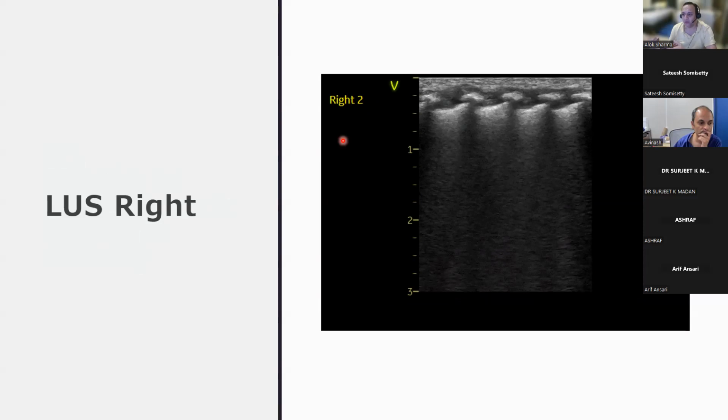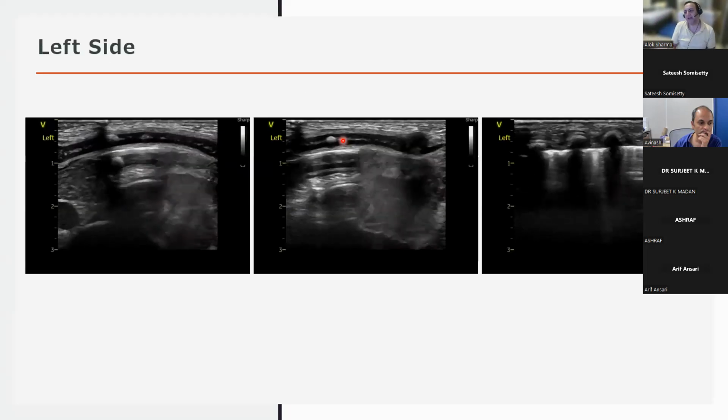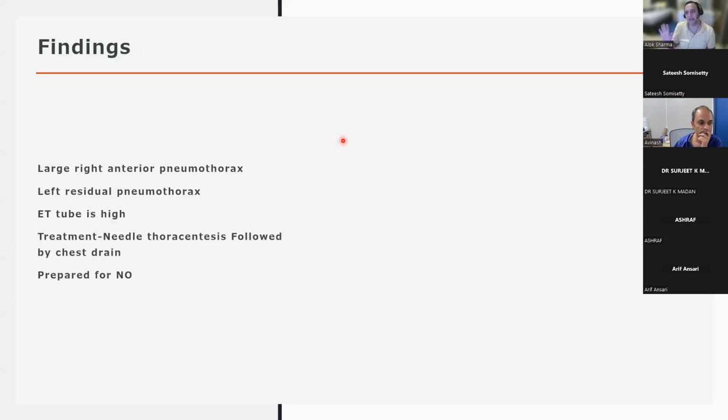I'm going to do the echo, but what I can do in the interim while we're placing the drains is get them to run the nitric through, basically prepare the machine after this, order the echo, so that really once I've done airway, breathing, and this is the pit stop approach. It's airway, breathing, circulation, and that's the order in which we're going to stabilize these babies. But that is what Satish has described really, really nicely.